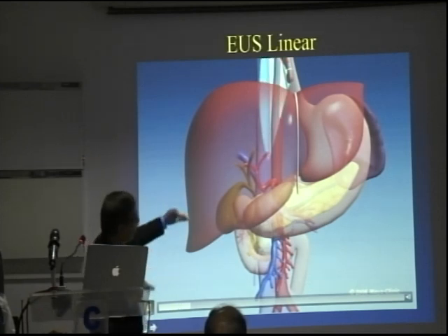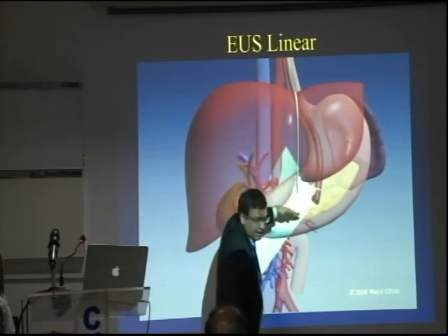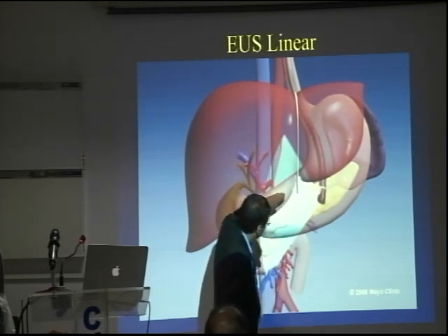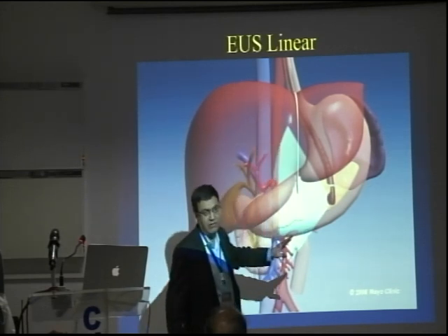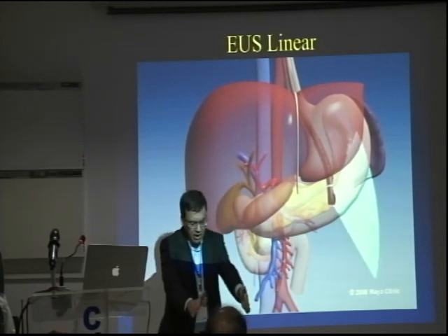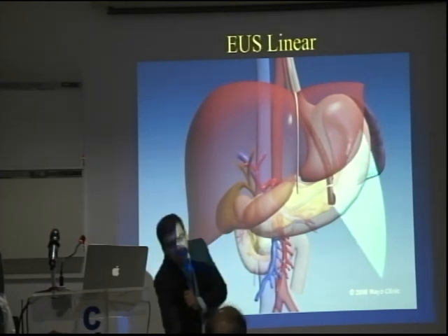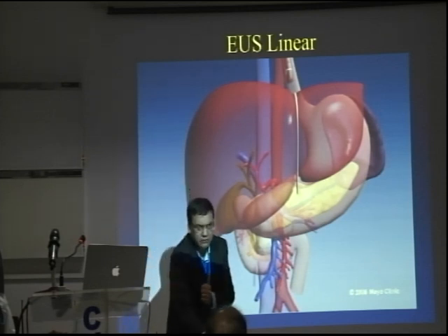So you're looking at the pancreatic body. If you're looking from the top down, that's what I would imagine. Here the portal vein is going to come first, and the bile duct is going to give you away from that. So you see a pancreatic body, you see a portal vein, and the bile duct is deep in there. Imagine that you're looking from top down on these structures.